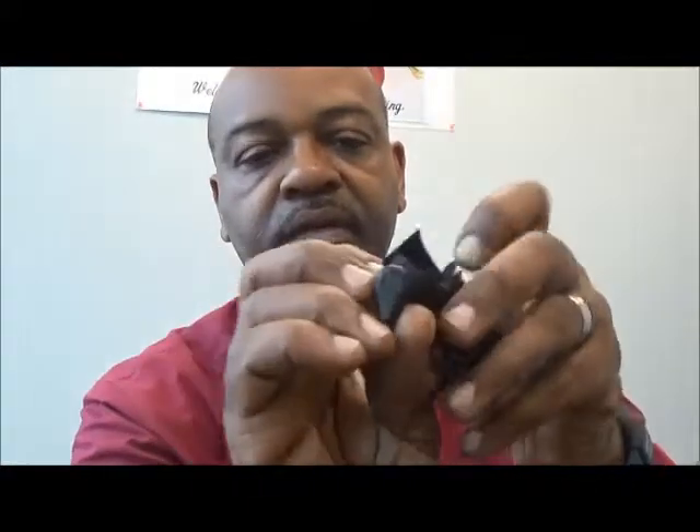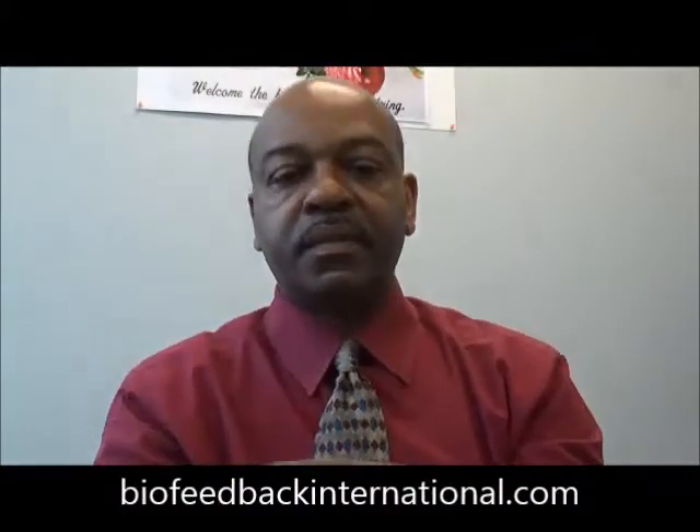It has two snap connector sensors. That snaps off and goes into this Velcro band. This happens to be Thought Technology equipment, but many other instruments use similar types of sensors. You have the snap on one side that snaps in here, and on the other side you have a silver/silver chloride electrode or sensor.